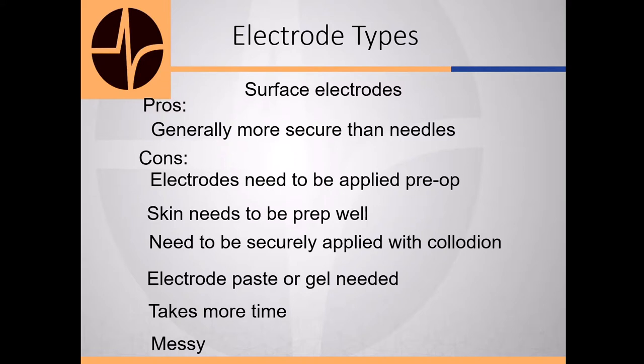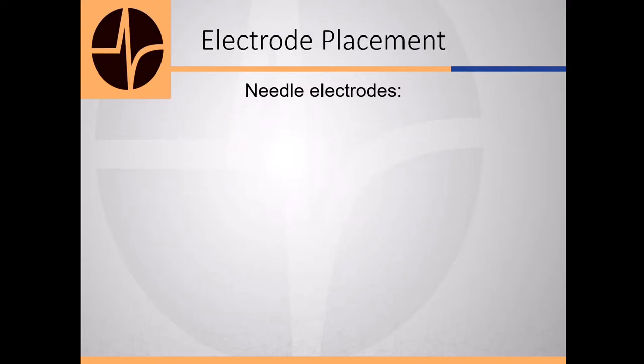You've got prep, you've got gel, you've got glue. You have to have a source for the air so that you can dry the glue. Is not very practical for intraoperative monitoring.